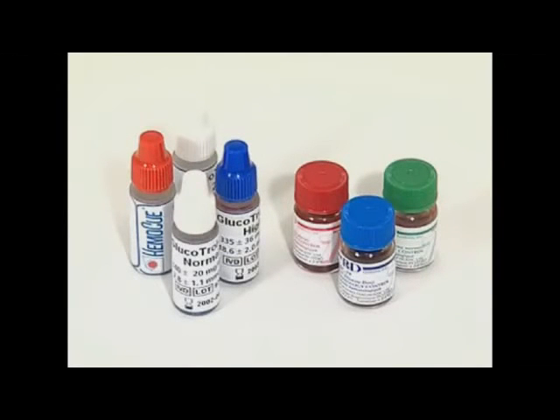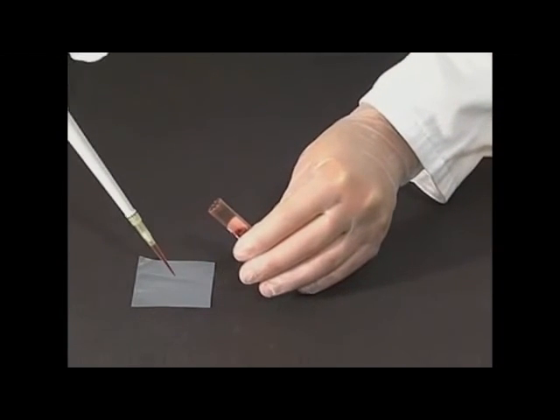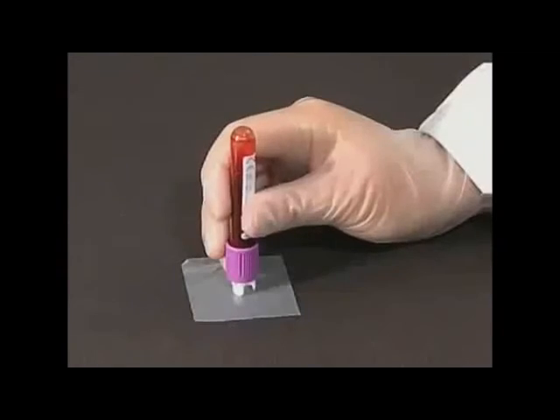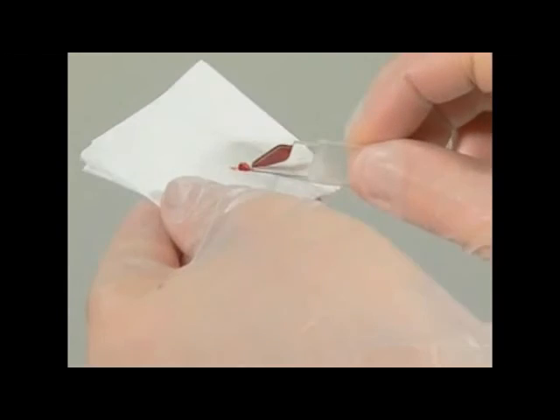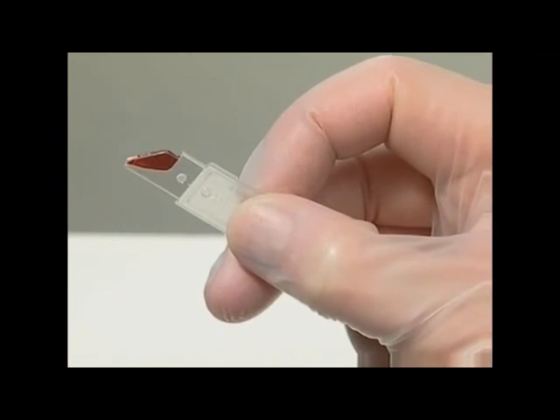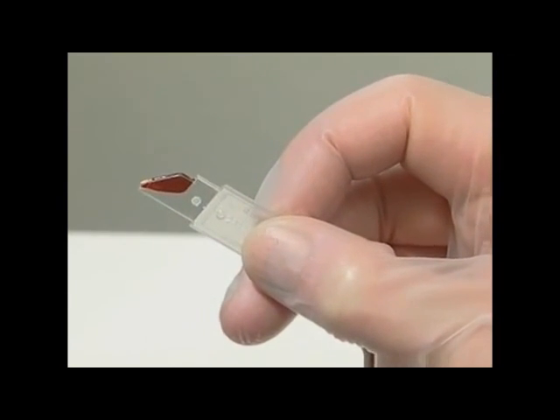For the correct use of liquid controls, follow the instructions of the manufacturer of the control material regarding storage, mixing, and handling. Place a drop of blood or control material onto a hydrophobic surface, for example a plastic film, using a pipette or a specifically designed transfer device. Fill the micro cuvette in one continuous process; do not refill. Wipe off any excess blood from the outside of the micro cuvette tip, making sure that no blood is drawn out. Look carefully for air bubbles; if any are present, discard that micro cuvette and take a new sample. Small bubbles around the edge can be ignored.